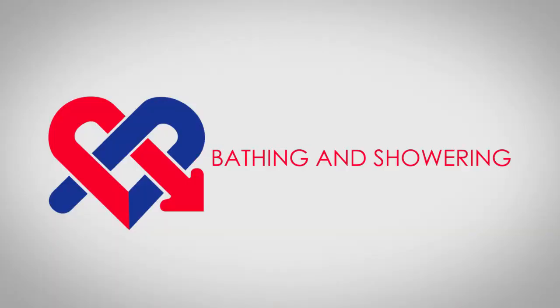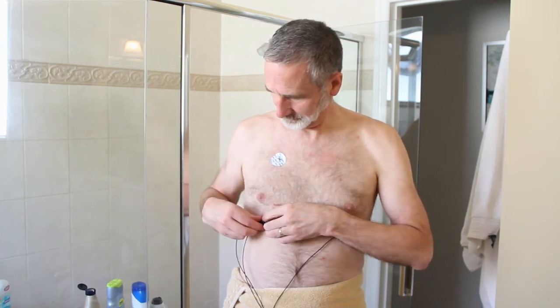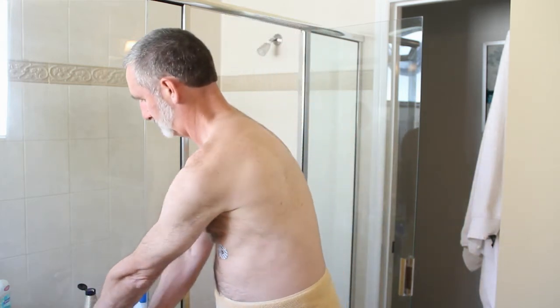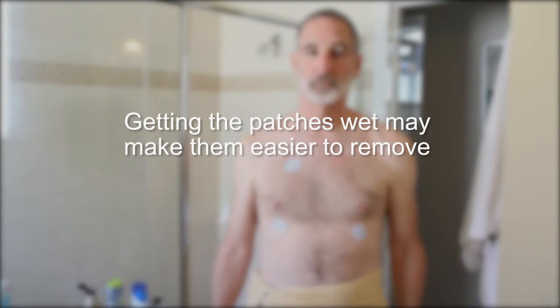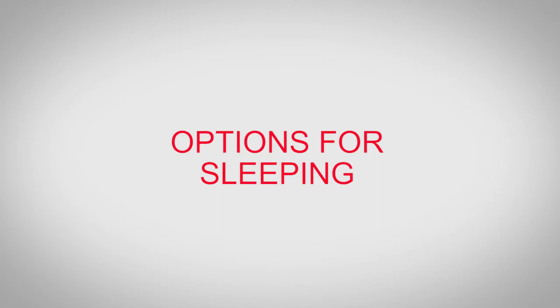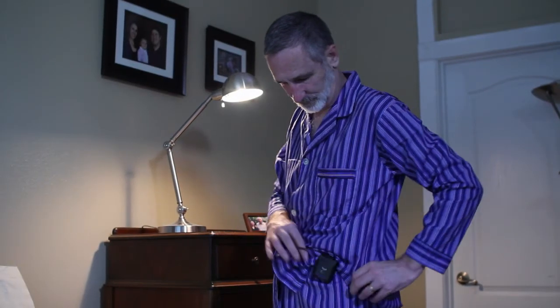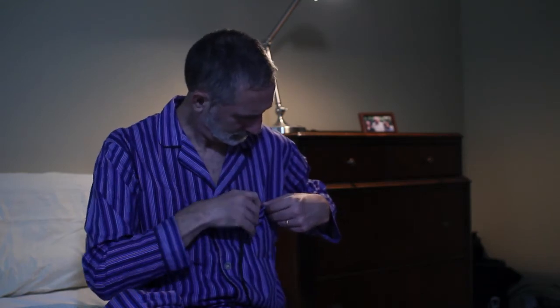Bathing and showering: before you shower or bathe, unsnap the wires from the electrode patches. You may leave the patches on your chest, but avoid applying water and soap directly to them unless you are changing your patches, in which case getting them wet may make it easier to remove. For sleeping, wear the pendant on the waistband of your night clothing, or place the pendant beside you with the wires extended so that you don't roll over the unit, or wear a shirt with a breast pocket and place the pendant in the pocket.